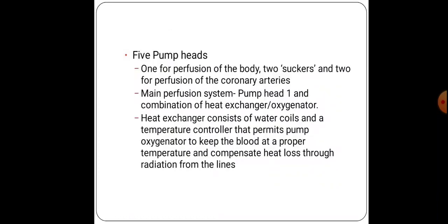As I already said, there are 5 pump heads. Two are for perfusion from the heart, and three pumps are for perfusion to the heart. One is for perfusion of the body, and another is taken from the right ventricle. Then there are 2 suckers, and 2 for perfusion of the coronary arteries, mainly for supplying the coronary arteries.